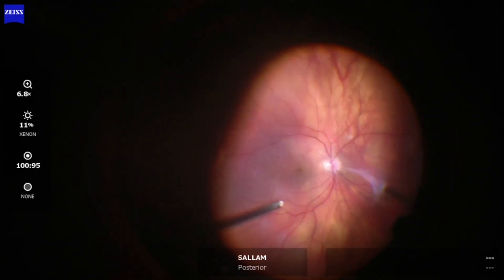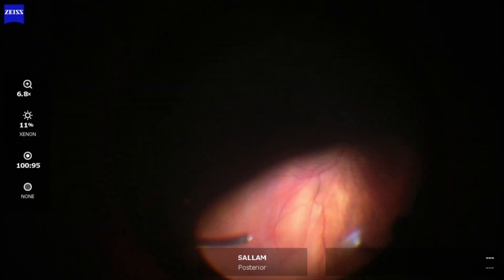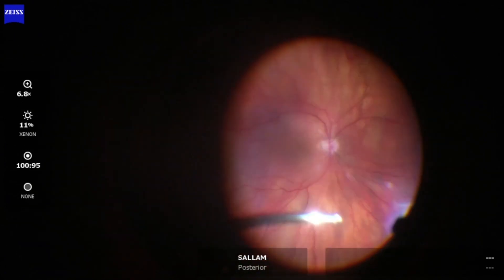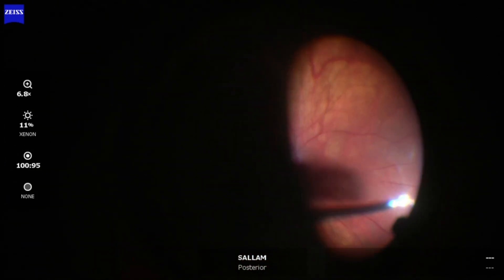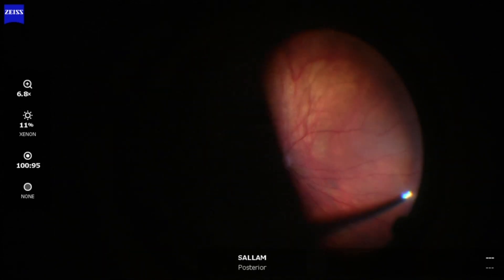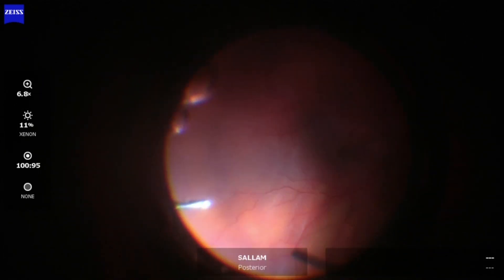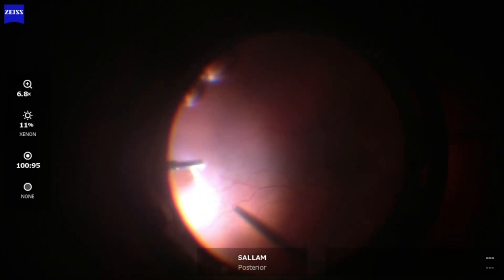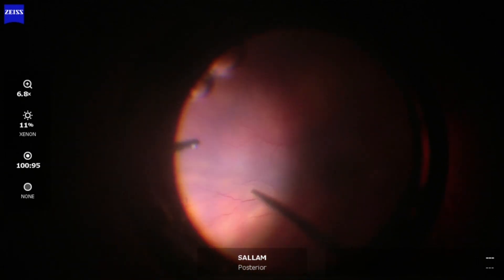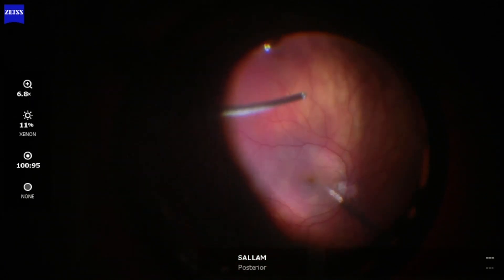This is the start of the vitrectomy, removing the core vitreous, then focusing on the periphery, cutting the vitreous back towards the periphery. The patient is phakic, so we are respecting the lens anatomy so as not to hit the lens while crossing to the other side. Now focusing on the superior retina, and now to the side of the vitreous cutter. Here is the main break, as you can see. Vitreous removal is continued to remove the vitreous on the side of the cutter.